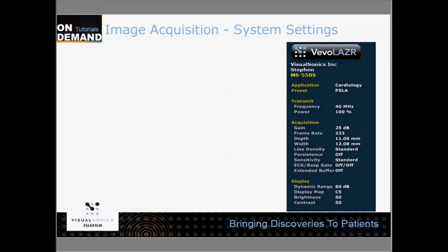So I did mention that I wanted to talk about image acquisition, and one of the really critical things, again, just to highlight, with these powerful post-capture analysis platforms, image acquisition, quality images, good image acquisition settings are really, really important. It is really kind of, as the old software programmers say, a garbage in, garbage out sort of proposition. If you have images that are a bit sketchy, they've got some artifacts in them, and you try to analyze them with something that is as able to pick up such subtle changes as VevoStrain, you may get really questionable results out of those analyses.